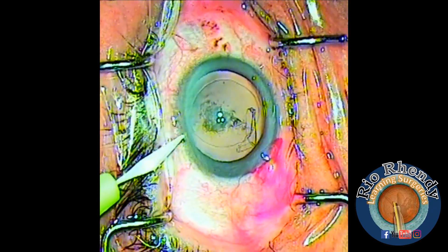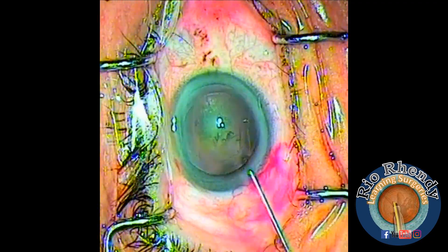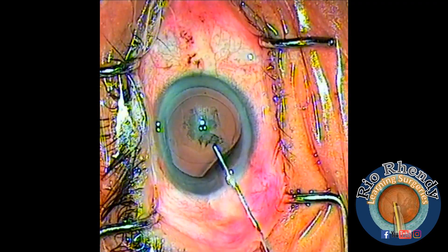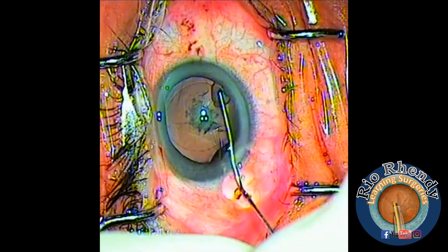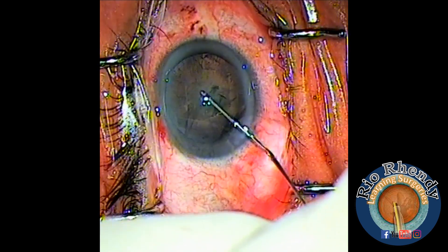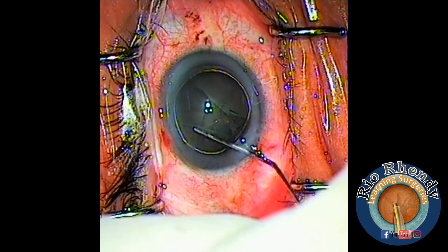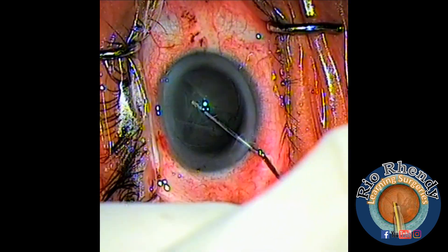The capsulorhexis is done — a nice circumferential tear. Now I make a side port with the 15-degree step knife at 8 o'clock, and I'm starting hydrodissection. We have to put the cannula behind the anterior capsule and inject fluid.